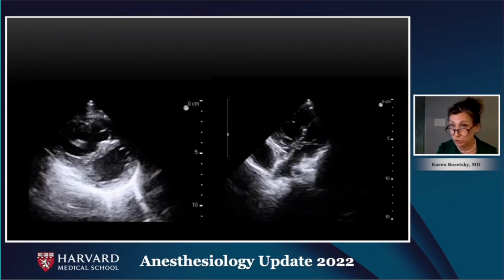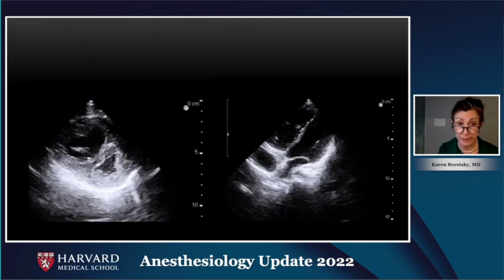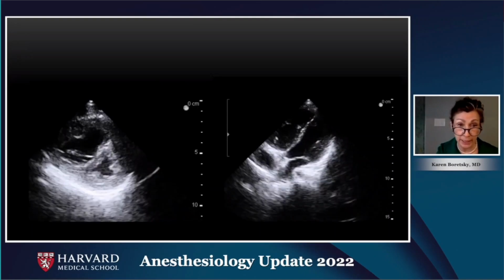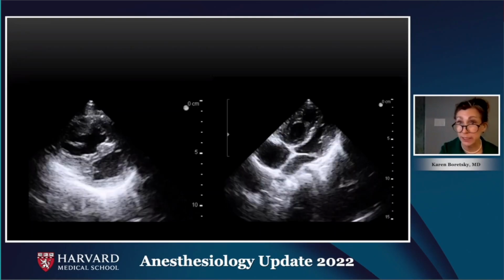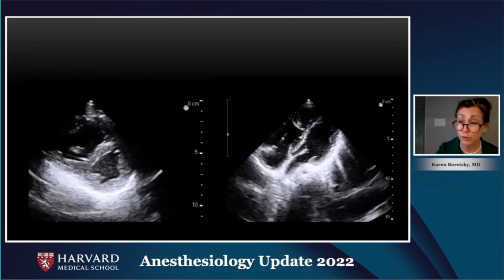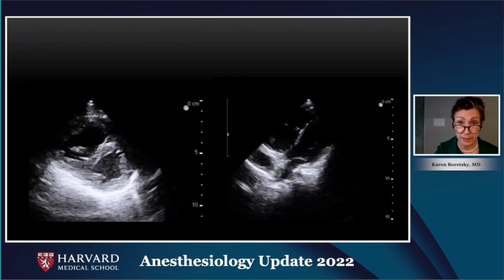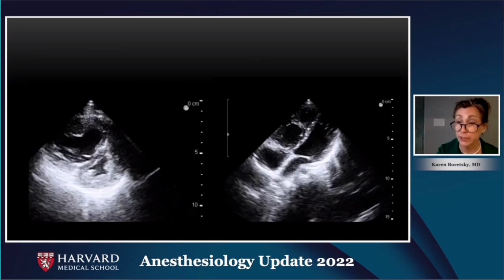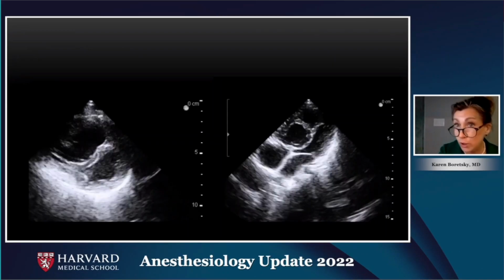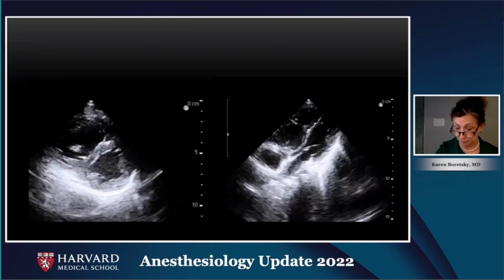We canceled the surgery, took the kid to the recovery room, proceeded to order a formalized comprehensive cardiac echo, and it was determined that the child had undiagnosed pulmonary hypertension secondary to pulmonary artery stenosis. The child went for additional therapies, and we really feel that we prevented this kid from not only dropping dead on our OR table, but from dropping dead on a playground somewhere unexpectedly.